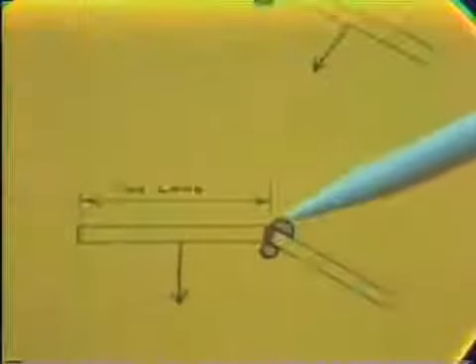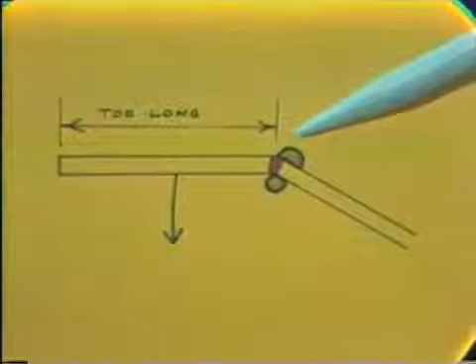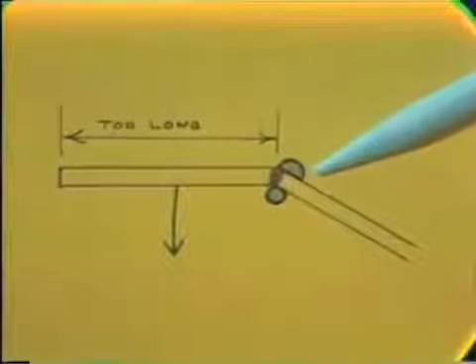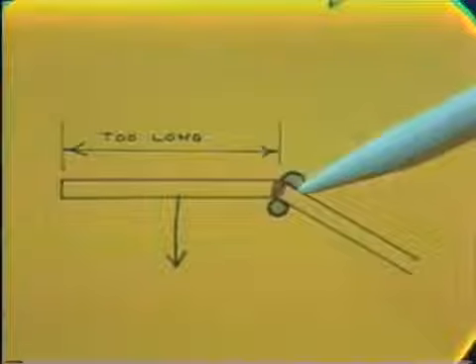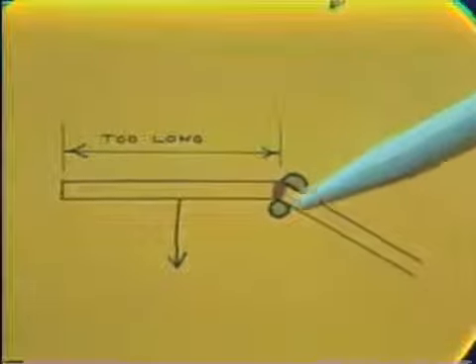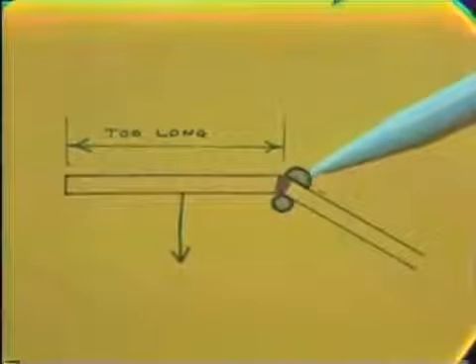If your bend was started too far down the wire, in other words, the first segment of the wire is too long, you grasp the wire beyond the pencil mark, and the first leg of the wire is bent back over the round beak of the plier. This will shorten this first leg in the wire and move the bend back.